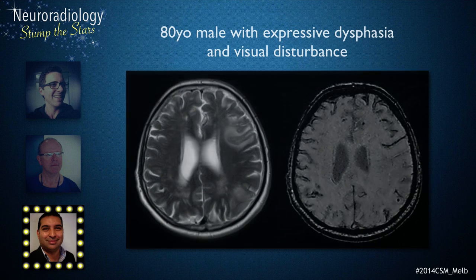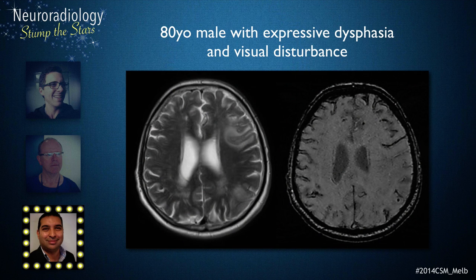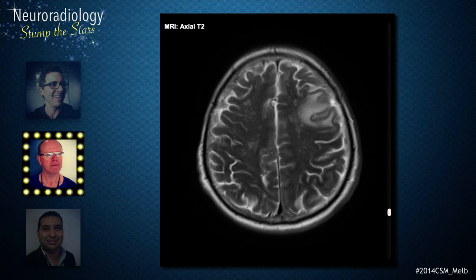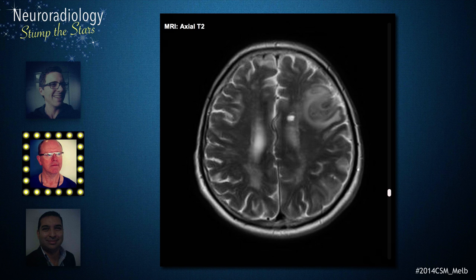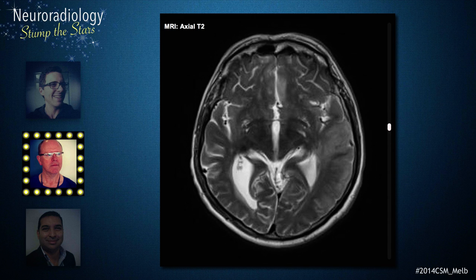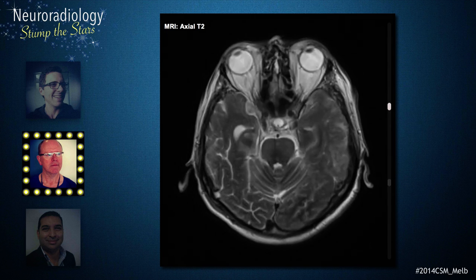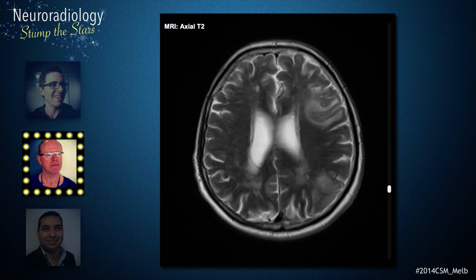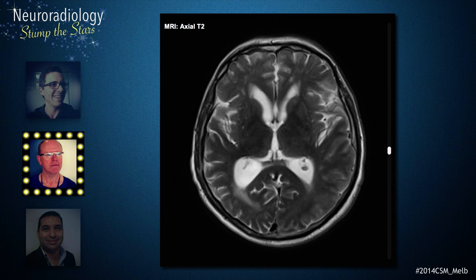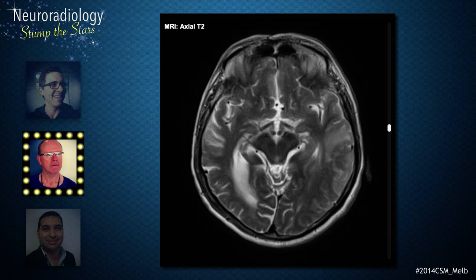The case is of an 80-year-old man presenting with expressive dysphasia and visual disturbance. The T2 axial scans demonstrate multifocal abnormalities throughout both cerebral hemispheres. The most striking abnormalities are in the left cerebral hemisphere, in the frontal lobe, as well as the parietal lobe, extending into the posterior temporal lobe.